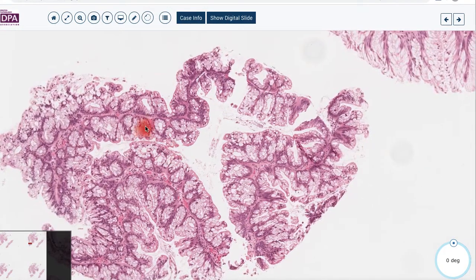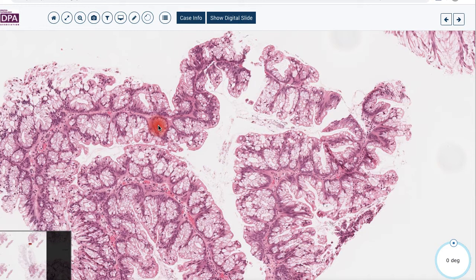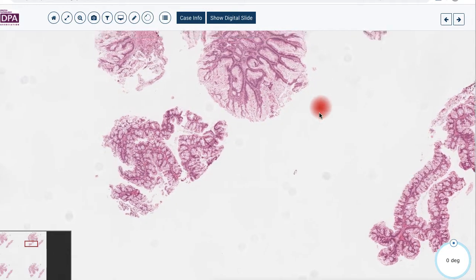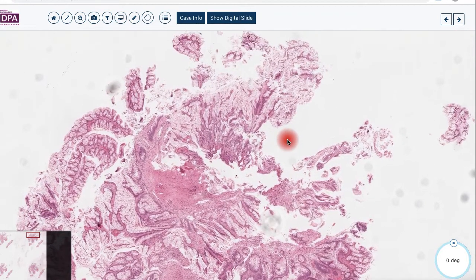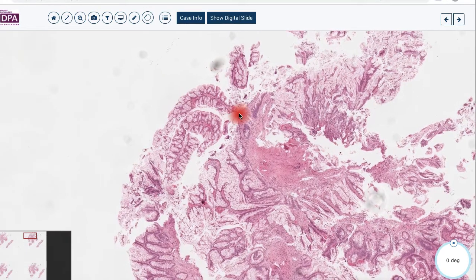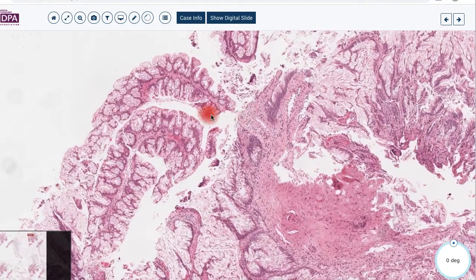secondary or ectopic crypts along the villous fronds, this qualifies as a traditional serrated adenoma and should be recognized and signed out as such. Now that distinction is of course important because the traditional serrated adenoma has a slightly different prognosis, and the follow-up would be similar for other moderate risk polyps with intervening colonoscopy at more frequent intervals.